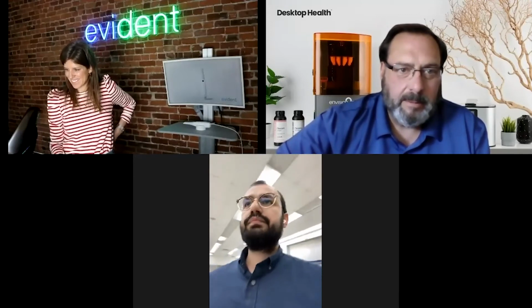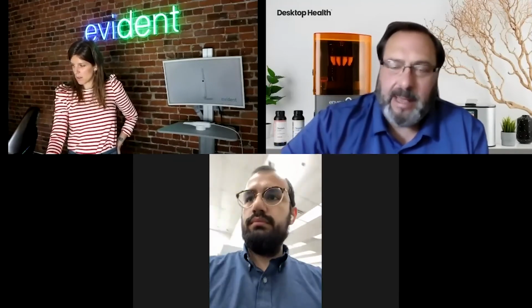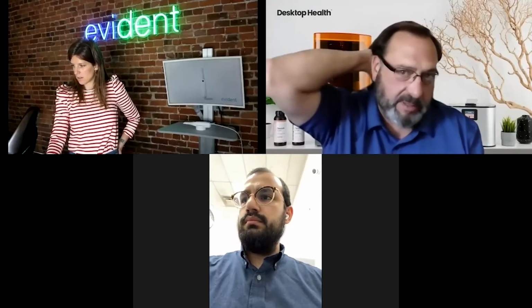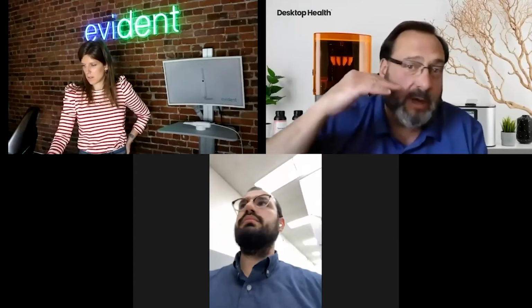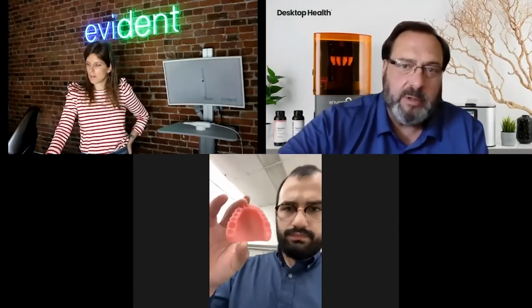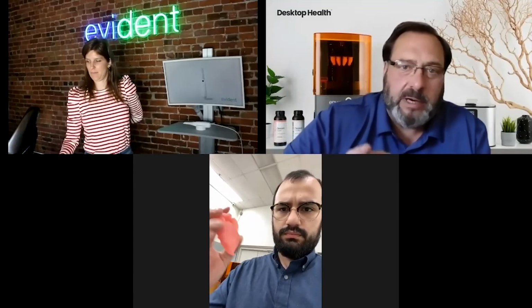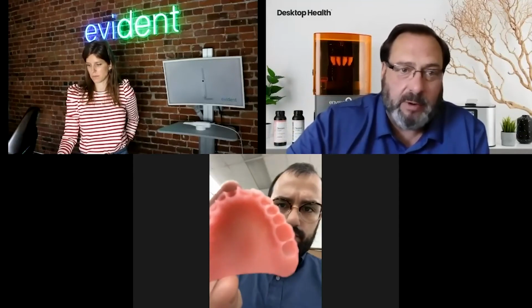Give me 1 second. One of the things he showed, that denture support that he has, it's an automatic file, because one of the difficulties in printing a denture is that if you print it in the horizontal orientation, it's either all over the palatal area or it's all over the intaglio surface. So this specific file preparation puts it right along the ridge, so you have no supports in the intaglio surface, or very little. And so the file preparation is important for us because we want to speed it up for the practice and not spend too much time creating supports.